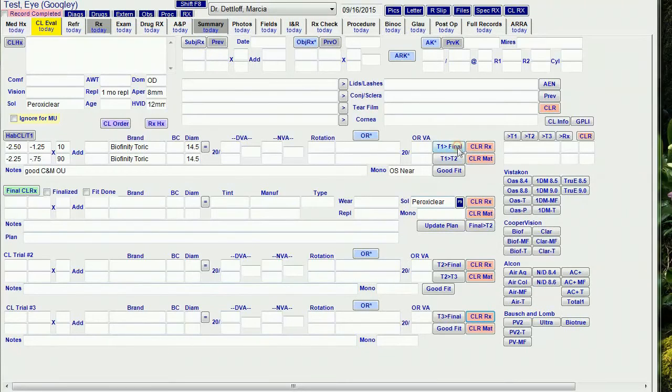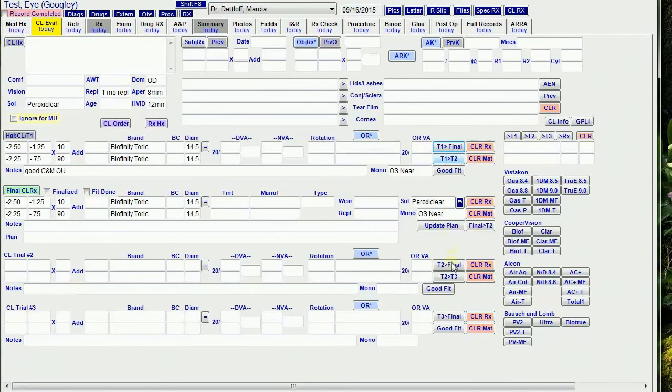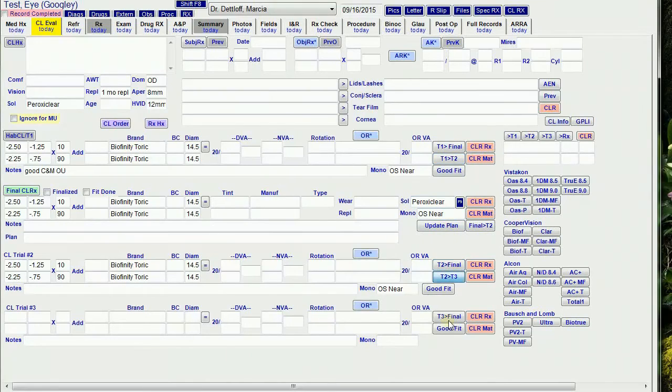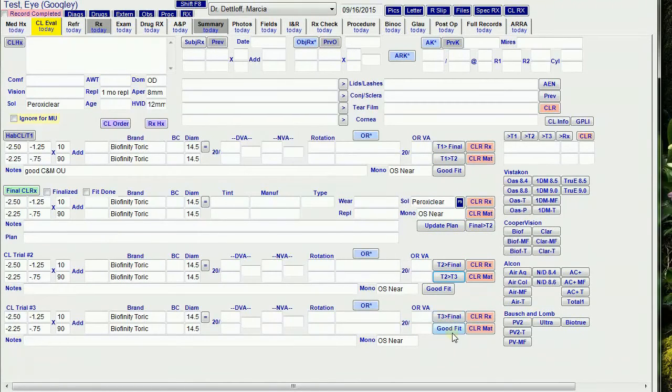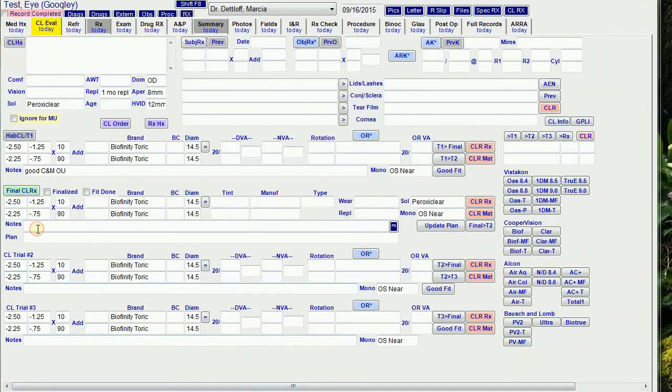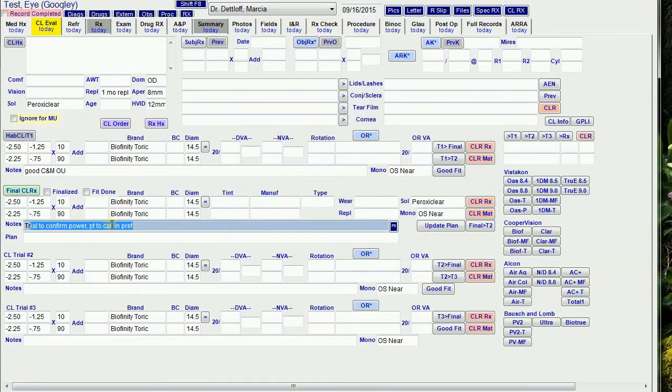These buttons let me copy T1 to final or T2, T2 to final or T3, and T3 to final. I still haven't figured out what I want to include for the good fit, so those buttons don't do anything. Let me put some notes in here before I finalize the RX.